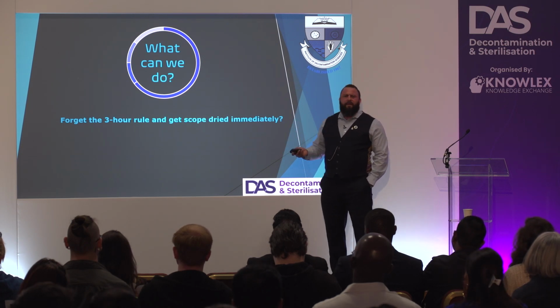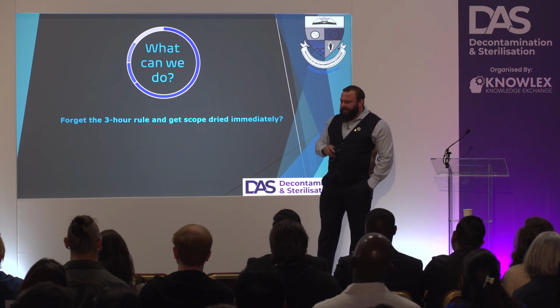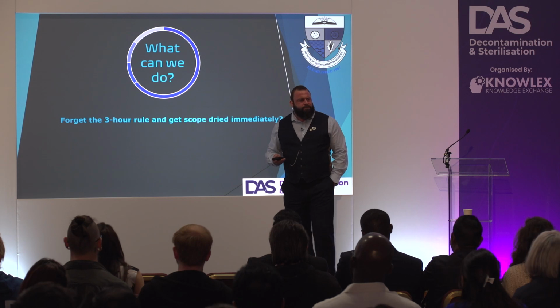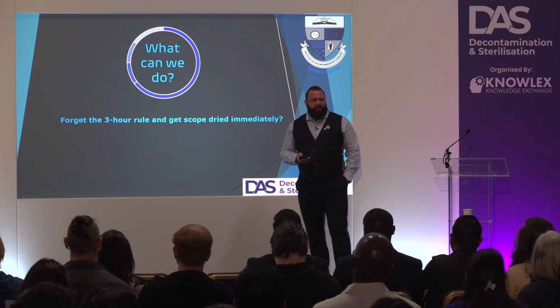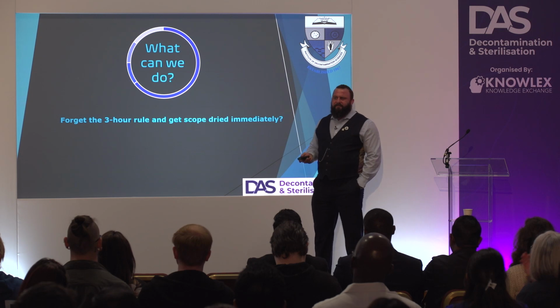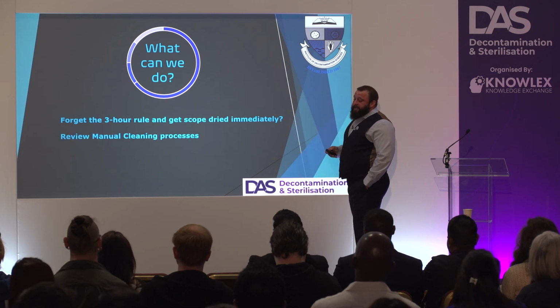I don't know why the endoscope manufacturers, we've been in a more standardized process for 15 years now, still haven't got an endoscope machine that can completely dry the scope. Why isn't that the focus? Anyway, review the manual cleaning processes.